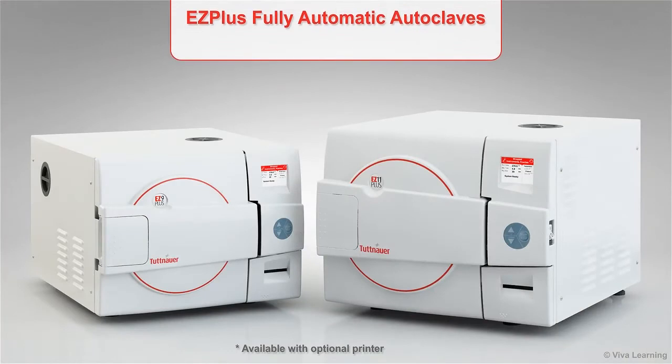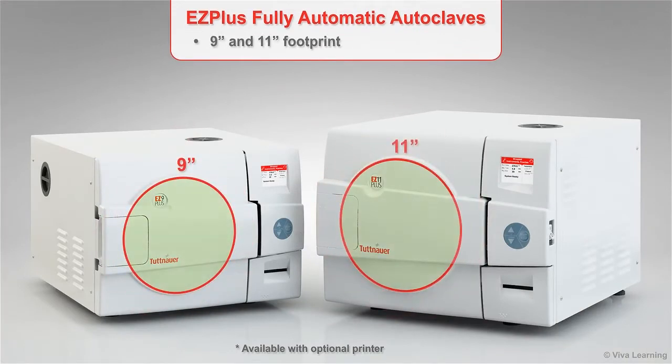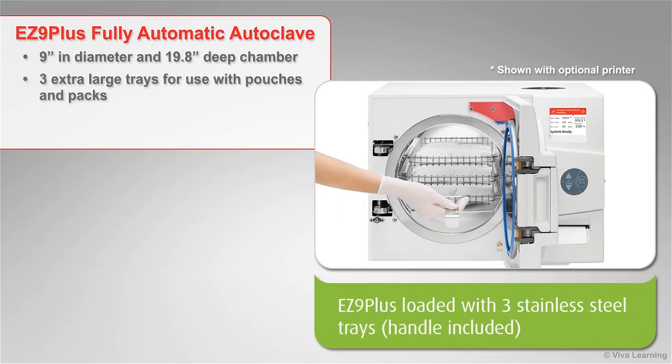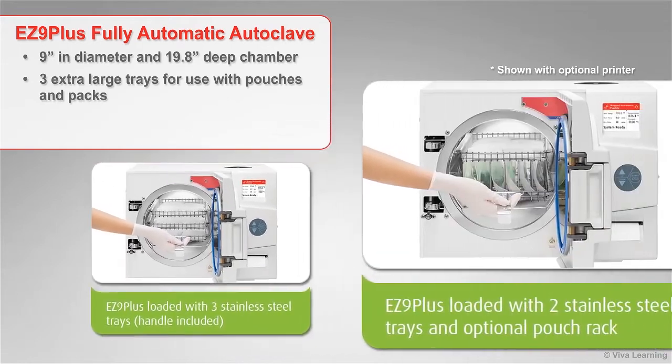On the outside, the EZ Plus footprint is very similar to other 9-inch and 11-inch autoclaves. Open the door though and you will be surprised to see just how much they hold. The EZ 9 Plus, which has a chamber that is 9 inches in diameter and 19.8 inches deep, has three extra-large trays for use with pouches and packs.